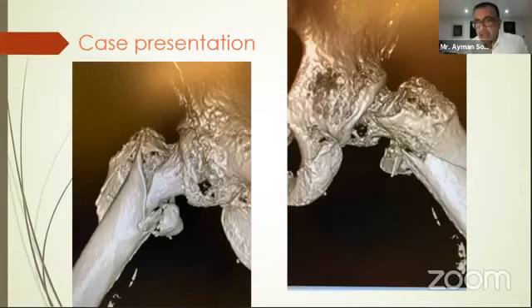And this is one of the difficult fractures to treat. And this is what I was saying, you can manage this either way. There are colleagues who would look at this. There is a reasonable amount of lateral cortex here. They would just do a DHS, and they are not wrong. But let me show you what I have done.